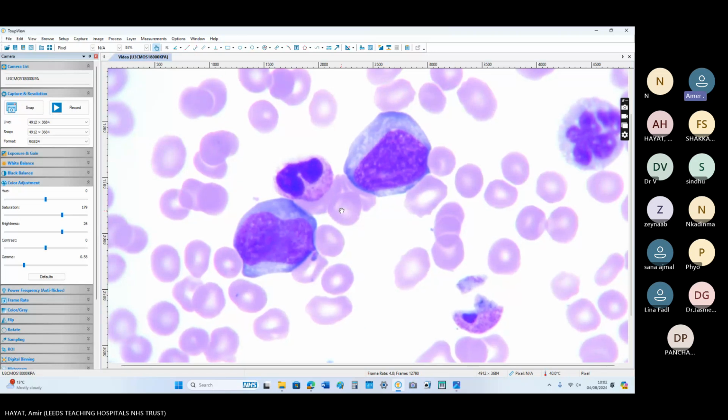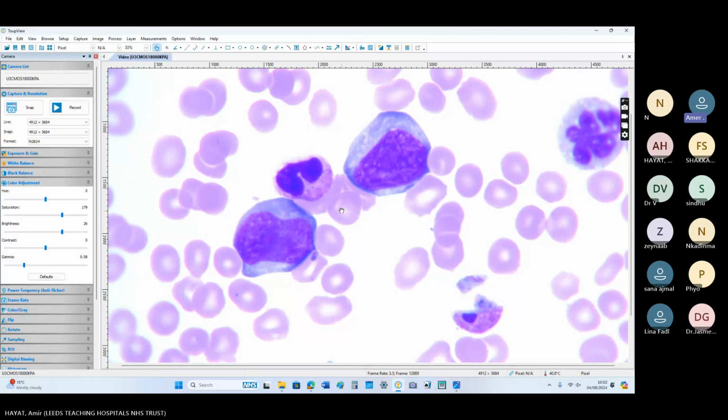The film is most likely consistent with high-grade lymphoma, because you see this type of large cells in high-grade diseases, Burkitt lymphoma and DLBCL only. The follicular, mantle, CLL, marginal zone have small to medium lymphocytes, but Burkitt and DLBCL have large cells. So you would say suspected high-grade lymphoma or lymphoproliferative disease.